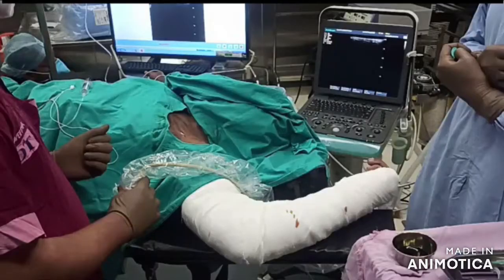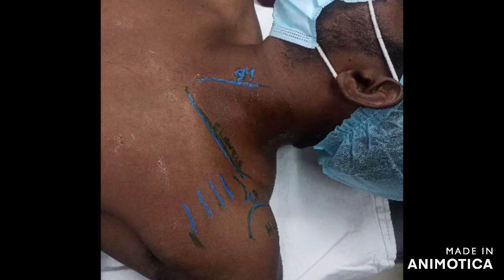Good morning everyone. Today we are going to look at the median infraclavicular fossa anatomy. This picture shows the logistics of this block — you can see the patient being abducted and the placement of the ultrasound machine and the person who is going to do the block.